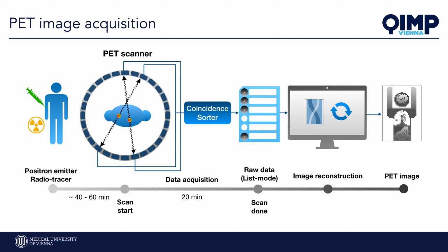So let's just really keep in mind that we have raw data that we can use and work with, and then also we have the image reconstruction, because this later will be important. I just mentioned earlier we need to take into account both modalities. But what is dose in nuclear medicine?